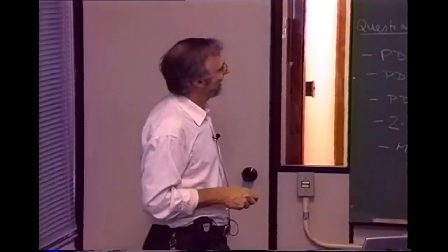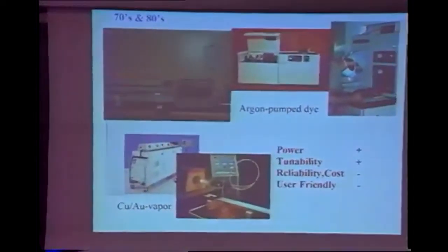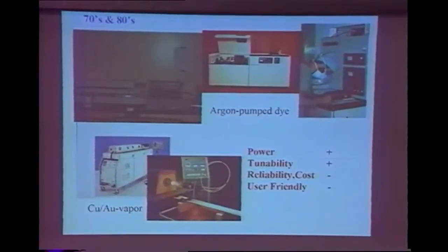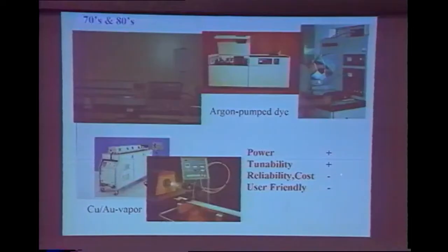This original technology, a number of companies tried to make this better for the clinical environment by putting it in a nice box. But the same core technology was inside, and it was very expensive. Good power, you could get several watts, tunable, which was a big advantage. Reliability was terrible, and it was very user-unfriendly.